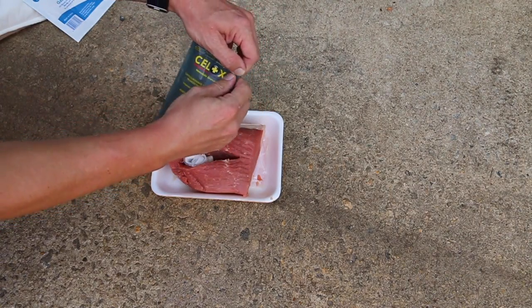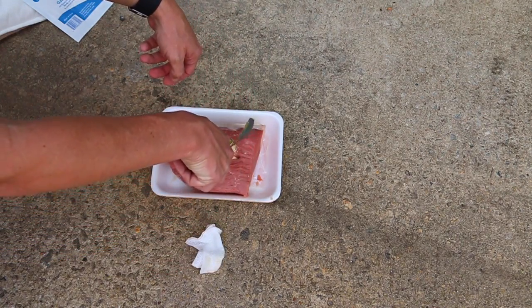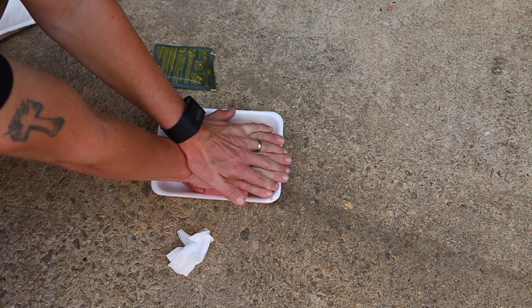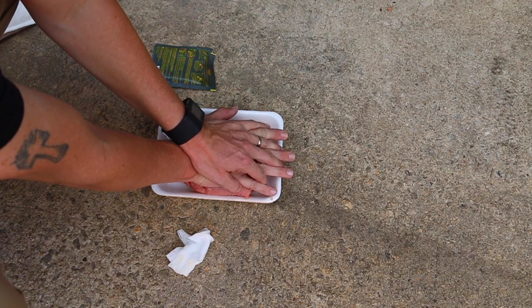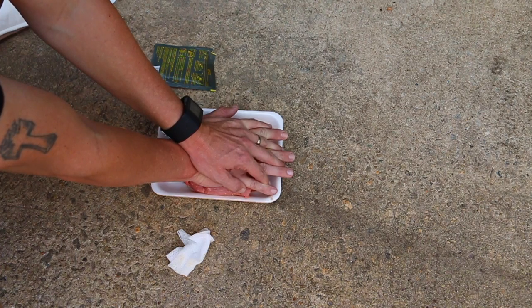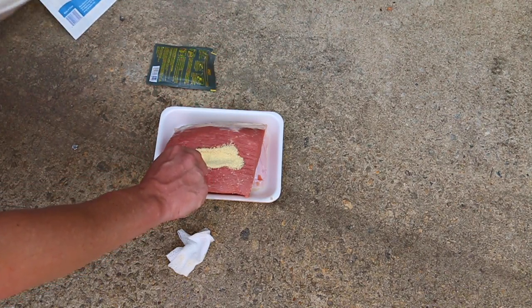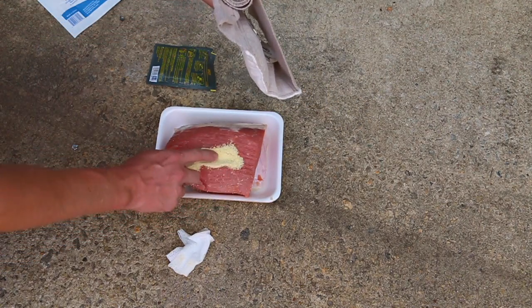This has a pull tab on it — just tear it open. We blot it out and then pour it down into the source. Now this is where I would take and hold pressure — a lot of pressure — for three to five minutes. If it's still bleeding after five minutes, then we need to probably put some more pressure on it or look at doing something else. Once your five minutes is up and you have bleeding control and you can take pressure off and you no longer have bleeding coming out of here, then you could use a pressure bandage to keep holding more pressure in place. It's got to hold everything in there.